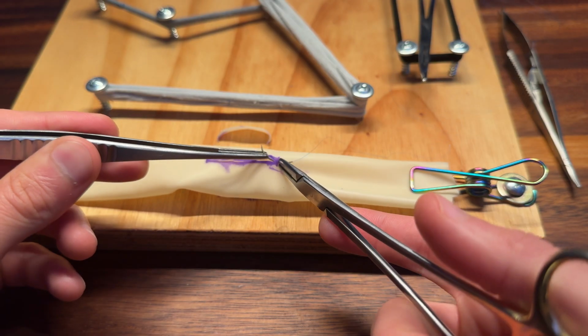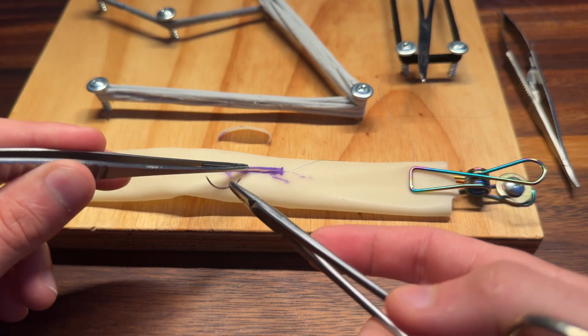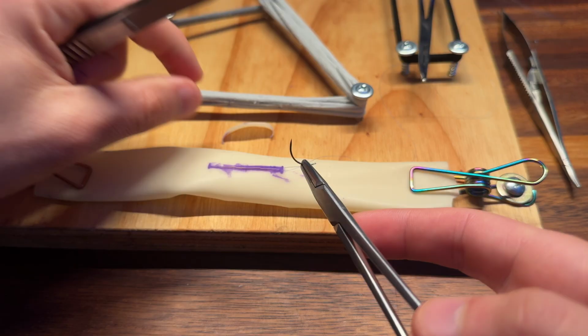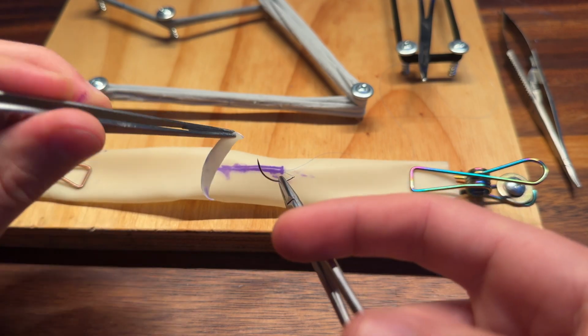And here it's always very important to take into consideration whether you're on the inside of the blood vessel or the outside. So right now we're on the inside, which means that my next pass on this tissue is going to be from the inside to the outside. You see, you've got to keep in mind what pattern you're using at all times.